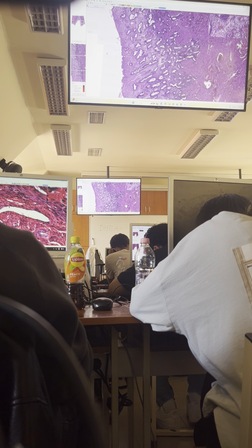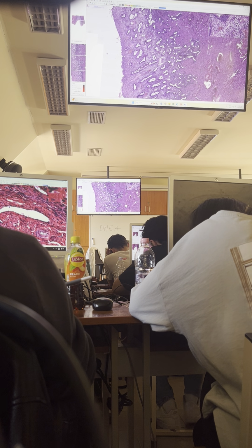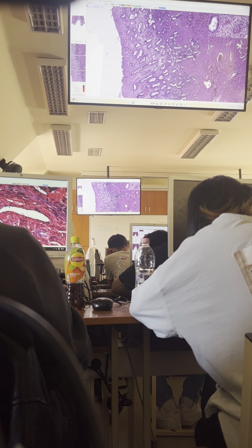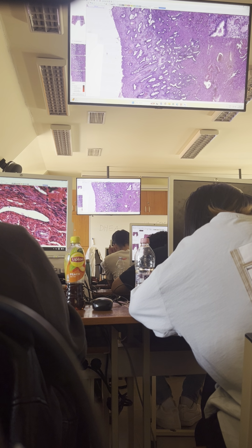And the reason why they are farther apart is that something accumulates in the extracellular matrix which pushes cells away from each other. This something is a fluid which is derived from blood. And therefore this tissue is swelling, this part of the functional layer. It is full of fluid, just like a sponge can be full of fluid, okay?